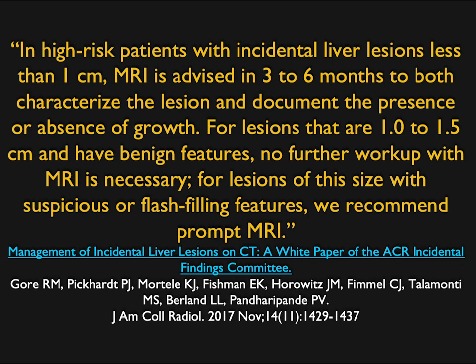Now, we do have another talk on liver incidentalomas that we're doing in the near future, so we'll go into that in more detail. But again, I think it's that strategy because in my mind, in a non-malignant patient, most incidental liver lesions are benign. Now, I'm not talking about a cirrhotic liver where you see a hepatoma. I'm just talking about a normal liver where you see a small lesion or it's a non-contrast study, you see a lesion. Then I'm thinking hemangioma, particularly in the women, particularly in right lobe.